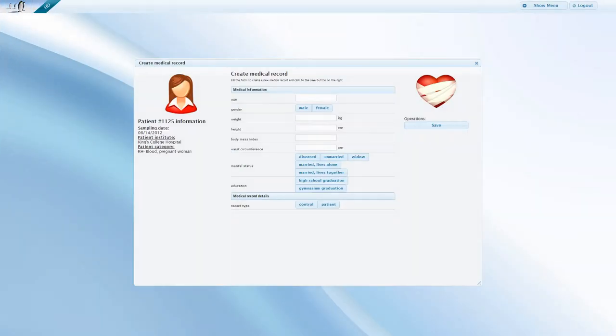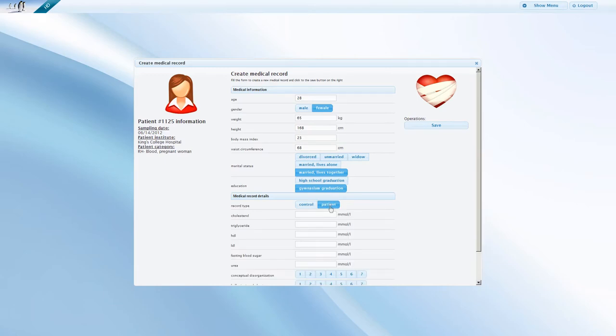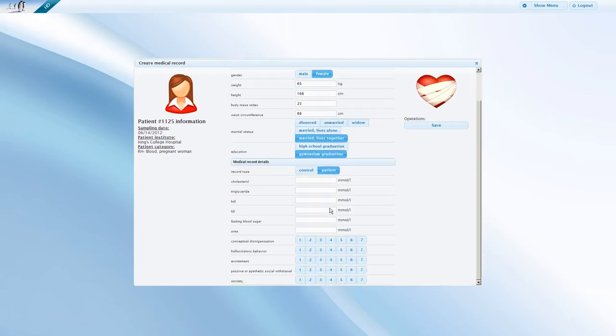This is the sample medical record that you see on the screen. In this example, we first enter some basic personal information. The same form can be used to record information about patients and controls. As information about medical conditions is only relevant to patients, these fields only appear if you choose patient as a record type.